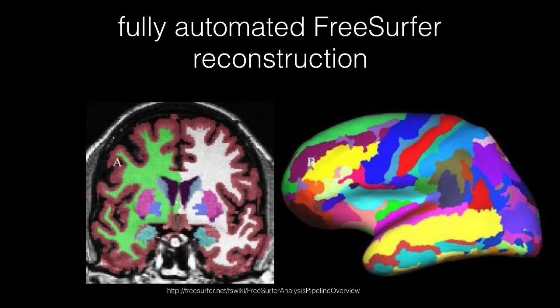One major advantage to using this method is that it labels voxels in what's arguably the brain's most complex structure of interest, the cortical gray matter ribbon. Its size and its convolutions and the number of regions it possesses with difficult gray matter cerebral spinal fluid boundaries make it really difficult for most labs to label it with manual or even semi-automated techniques.